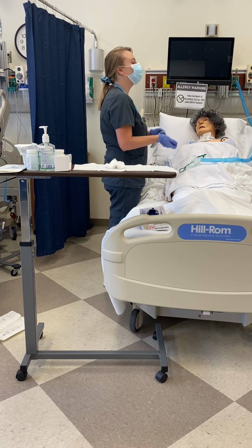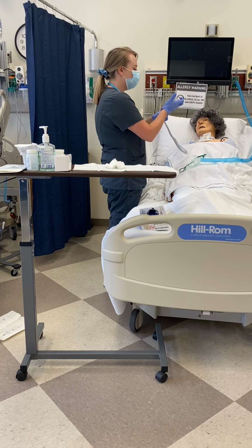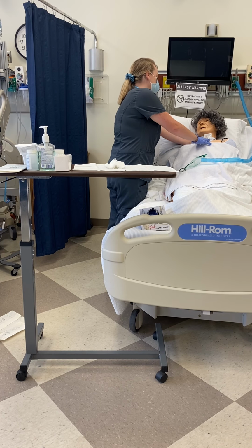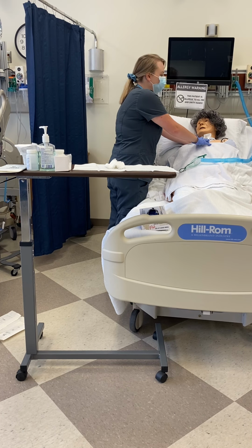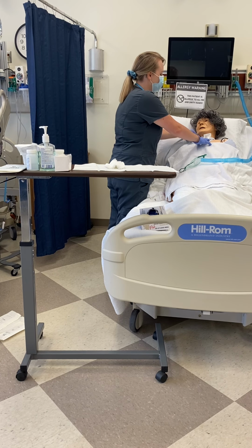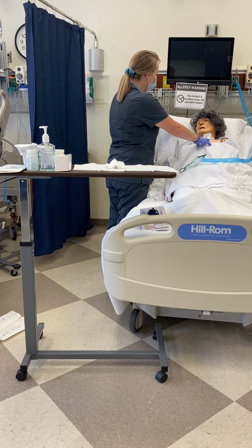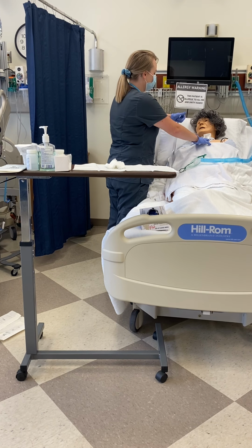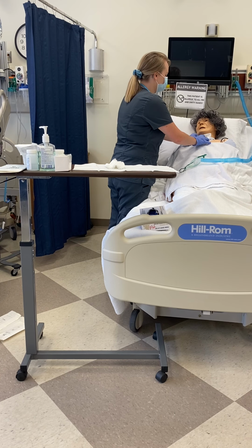Usually you would see if you can find somebody to help you with this, to hold the cannula in place, but with it being just me, I will make sure I have one hand on the cannula at all times until there's a necktie secured around it.